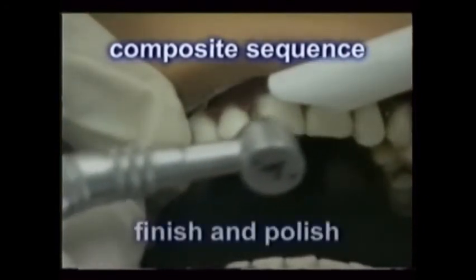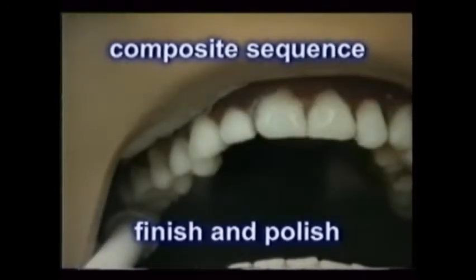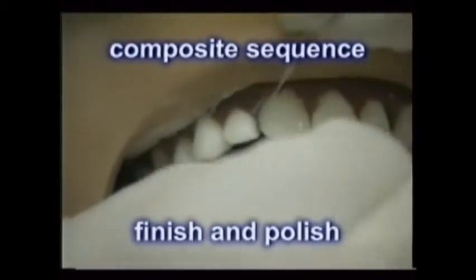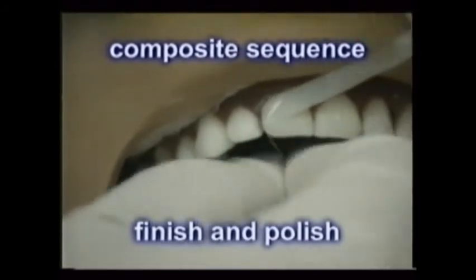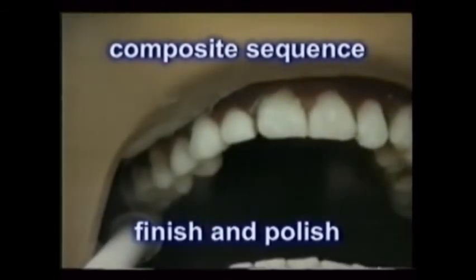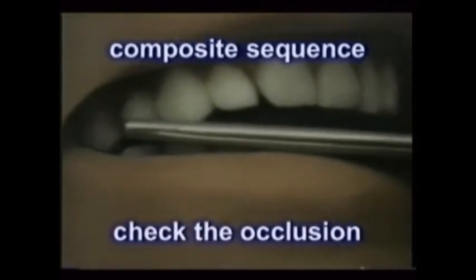After the filling is set using the very bright curing light, the filling is shaped with fine-toothed finishing burs prior to its final polishing. Slow-speed sandpaper discs and handheld paper strips can also be used to further shape and finish it. Final polishing is done with special pastes and rubber cups or brushes in a slow-speed handpiece. Finally, the occlusion is checked using articulating paper.